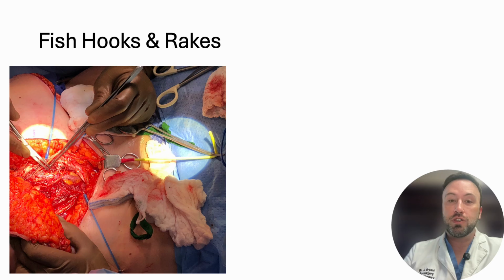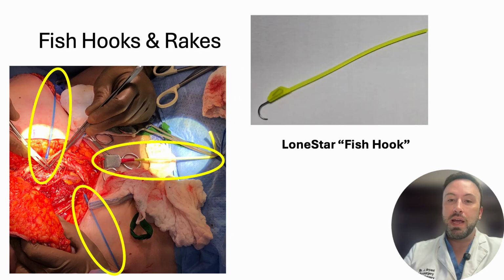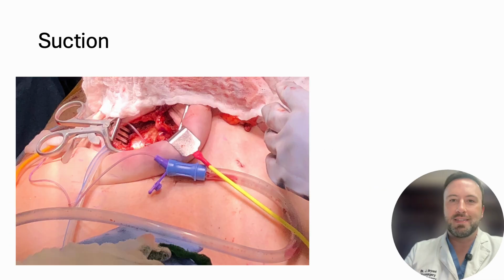Lone Star retractor stays, commonly called fish hooks, and Lone Star rakes are commonly used during microsurgery dissection in order to provide constant, self-retained retraction.